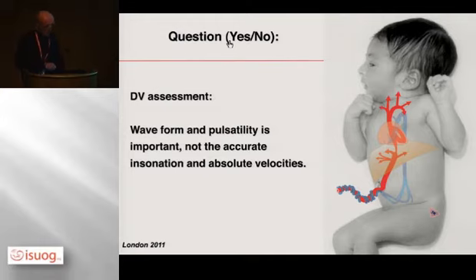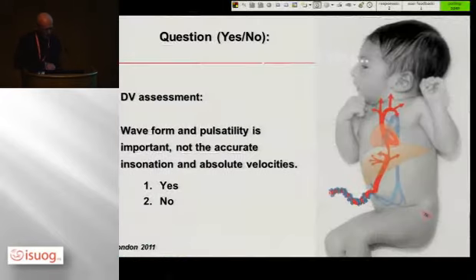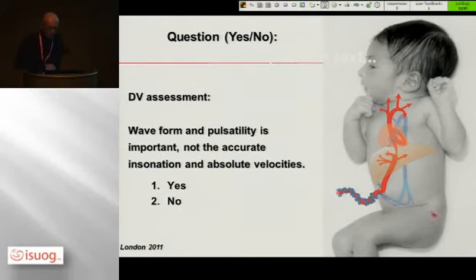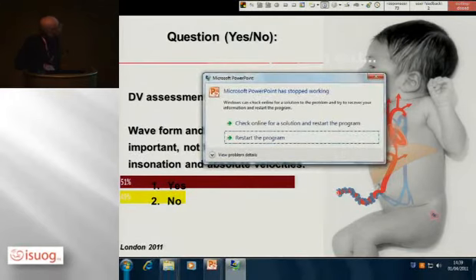So once we got to this, I would just like to ask you the first question, as we've started doing today. And this question is concerning the DV assessment. Waveform and pulsatility is important, not the accurate insonation and absolute velocities. Do you agree? So if you have the waveform, you don't need the angle correction. You just have the waveform, and the pulsation you can assess by the A wave. Then absolute velocities and insonation isn't that important. Okay, we continue then, and we'll answer the question later on.